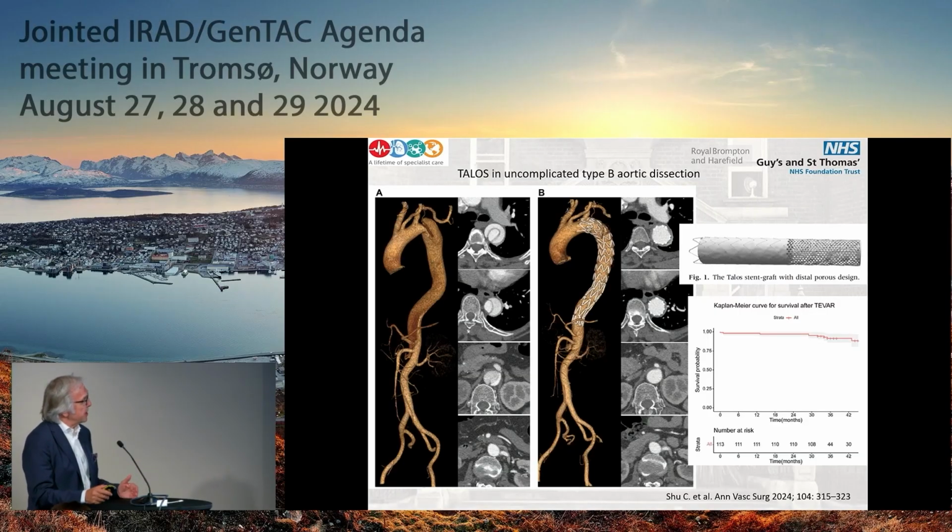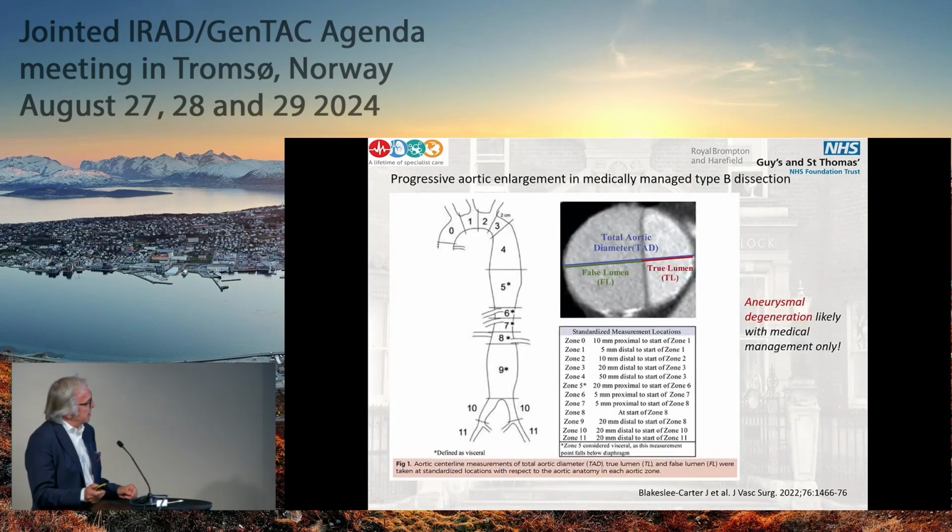What can be done and achieved was recently published in this series from China, which really is again the use of the single-branched unibody device with an attached petticoat or distal open stent device, as you can see in the upper right corner. This unibody device comes in one piece, allows basically to implement the benefits of distal scaffolding with a petticoat or open stent configuration. And obviously this observation from a single center in Beijing is quite intriguing.